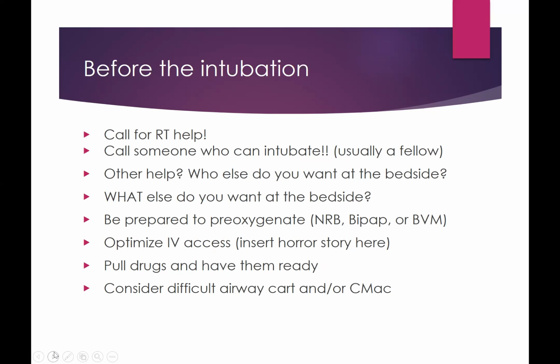Do I have access to those things? If the physician is unable to intubate, what's the next step? Do I call anesthesia? What's their phone number? Mostly because I don't like to be in an emergency scrounging around for things. I like to be as prepared as I can be. And I may not need any of those things. It may go very well, but I'd much rather have it and not need it than vice versa.